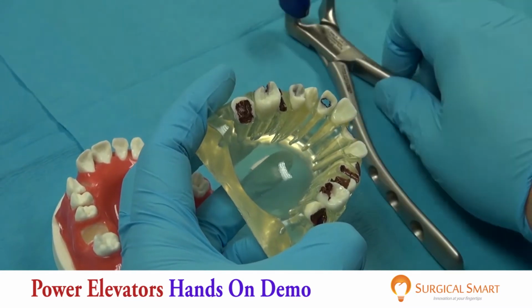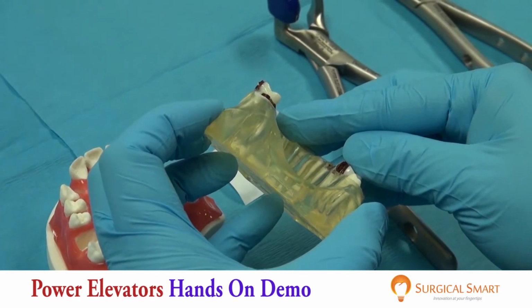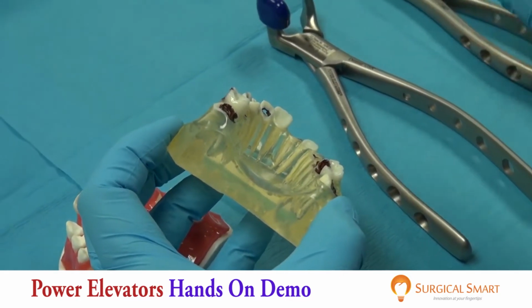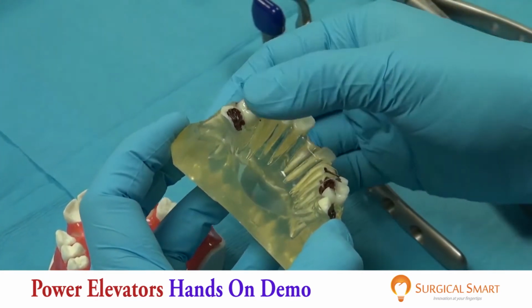Okay, so for example, this tooth, as you can see, used to be flush, and now it is basically elevated out of the socket. You can now take a standard molar forceps and just grab it and pull it out because the whole thing is already loose.